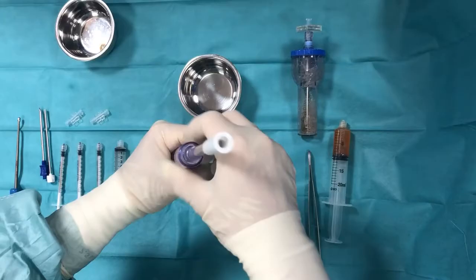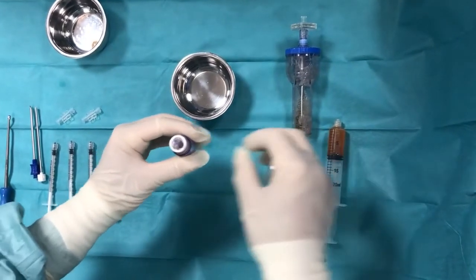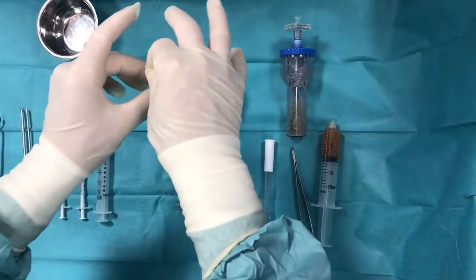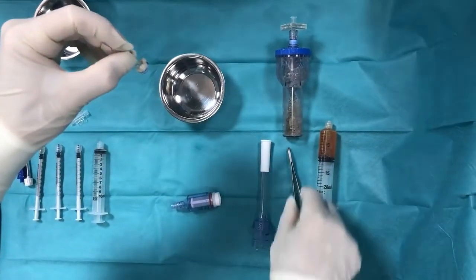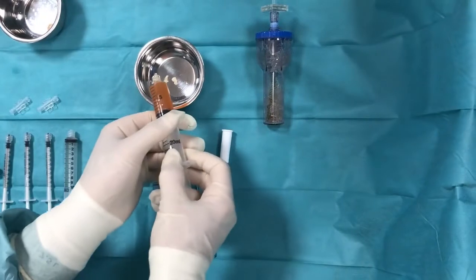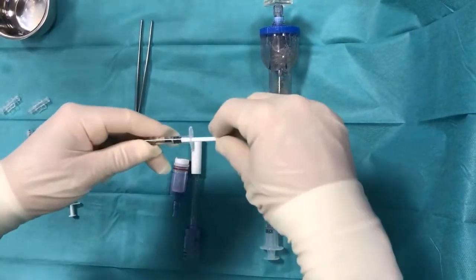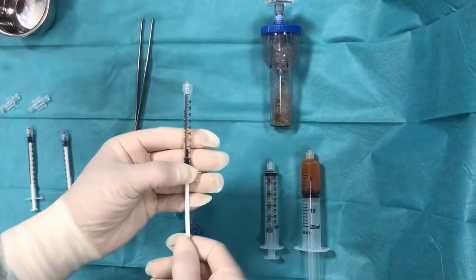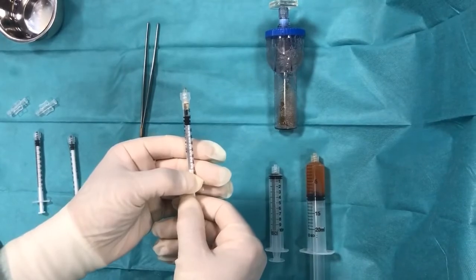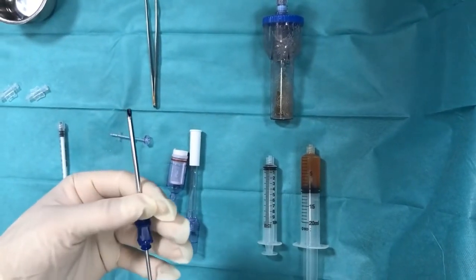Remove the graft net from the handpiece and transfer the cartilage chips into a small sterile bucket. Add a few drops of ACP and mix it. Load the cartilage particles into a one milliliter syringe, then transfer them into the application cannula and push the trocar forward until the chips appear at the tip of the cannula.